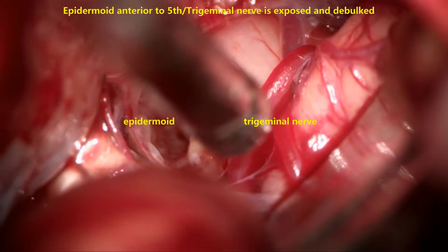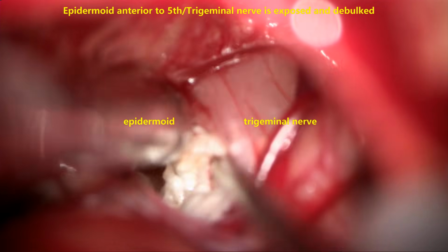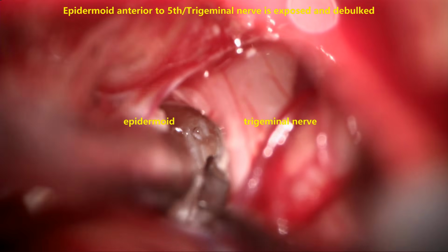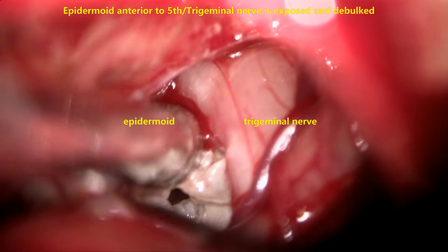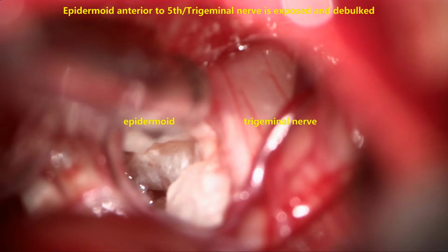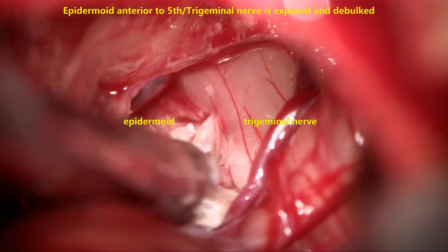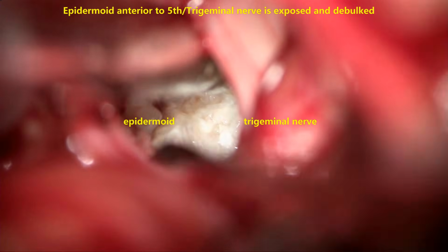The capsule is opened and in between the 7th, 8th complex inferiorly and the trigeminal nerve superiorly, the space is about 1 centimeter. Through that space, we start the dissection and debulking of the epidermoid and taking it out from the anterior aspect of the trigeminal nerve. The aim here is to decompress, remove the epidermoid 360 degrees from the trigeminal nerve.